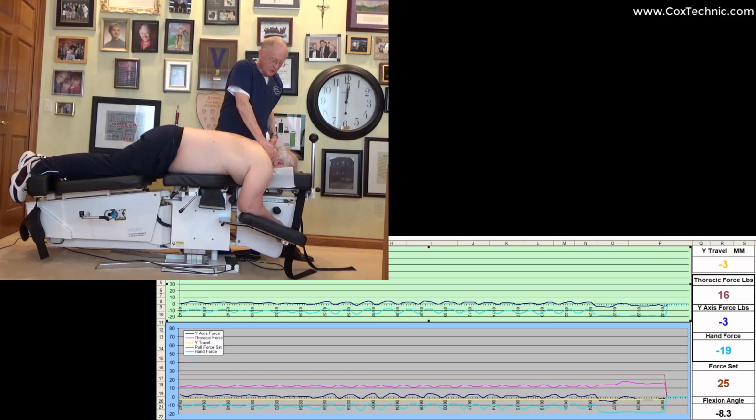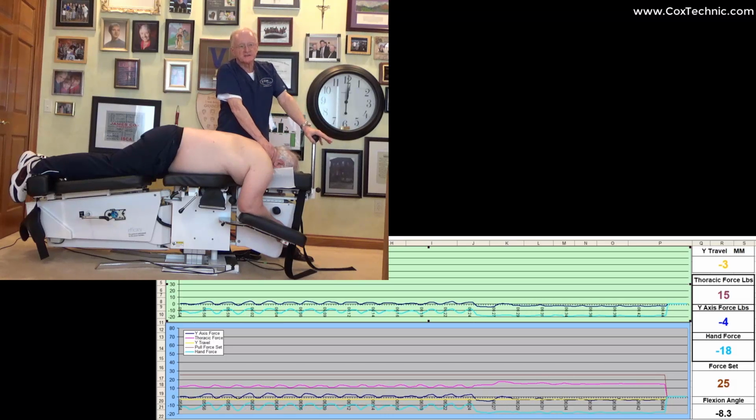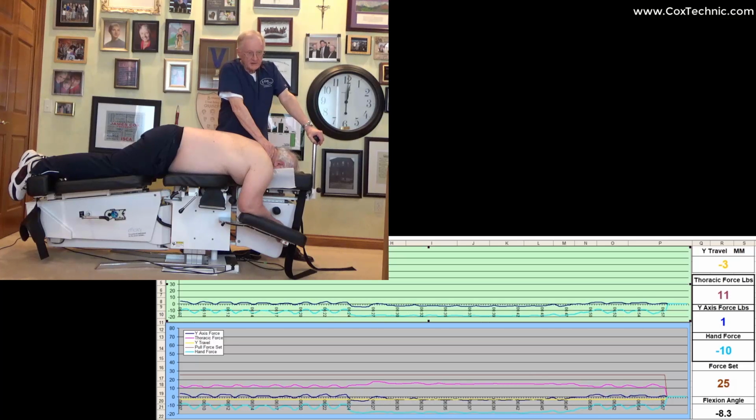Okay? So this would be the manual application of disc herniation in the neck. Always contact above the disc, apply the 3 20-second distractions consisting of tautness and the 5 4-second pumps, reducing cervical lordosis, my contact and the tiller bar moving in parallel, and you can see the force I'm using is about 3 to 4 pounds. That's the maximum I use.